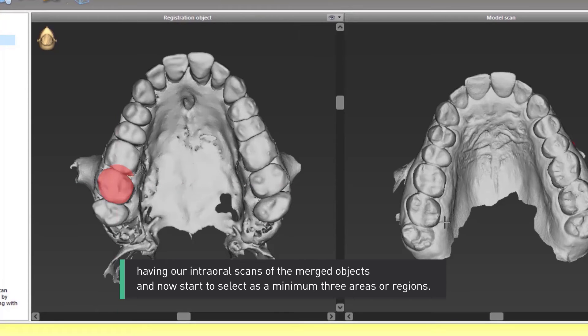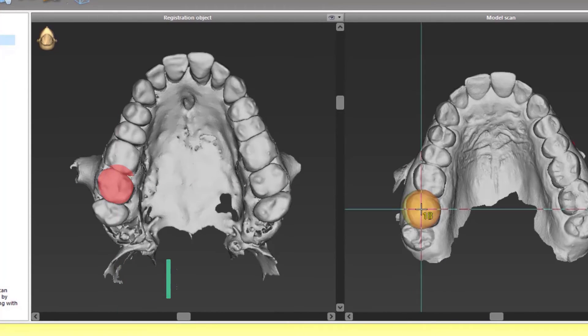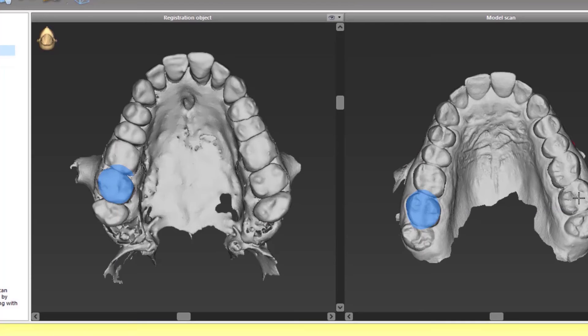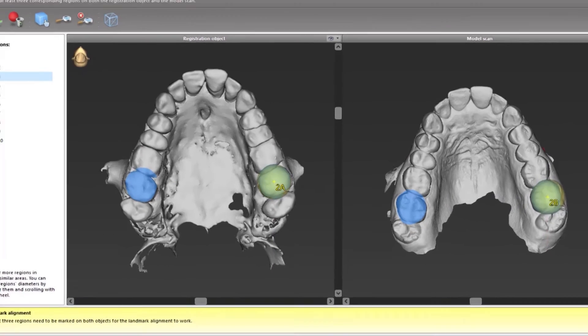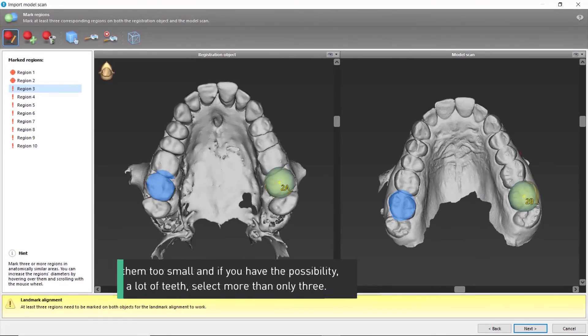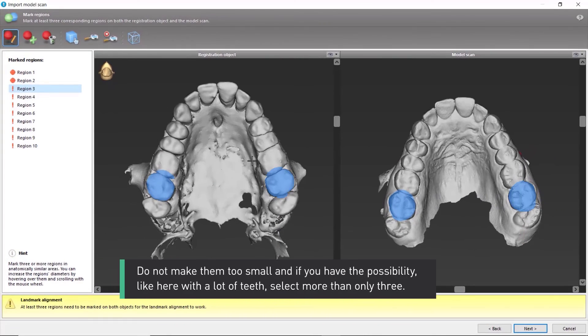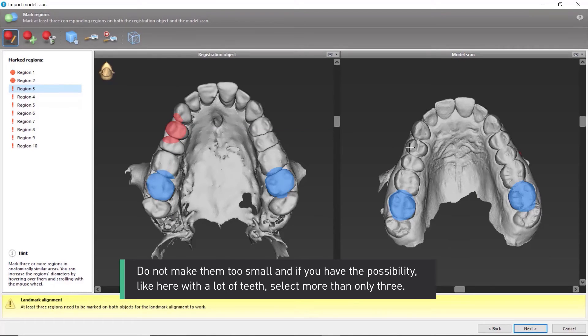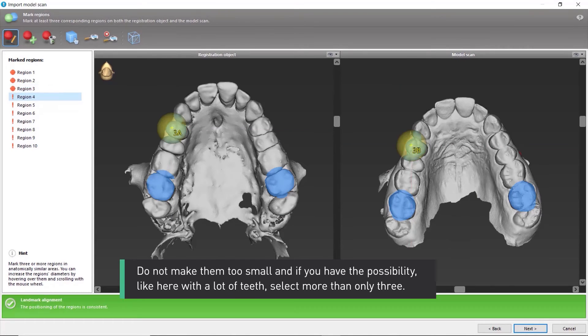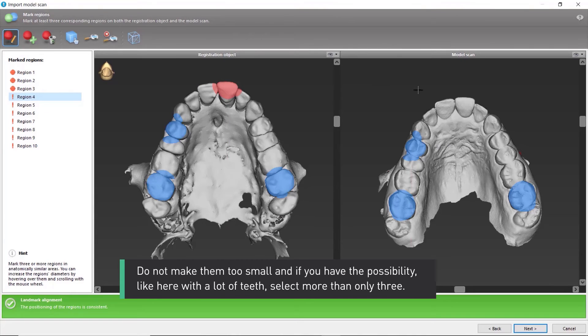as a minimum, three areas or regions. Do not make them too small. And if you have the possibility, like here with a lot of teeth, select more than only three.